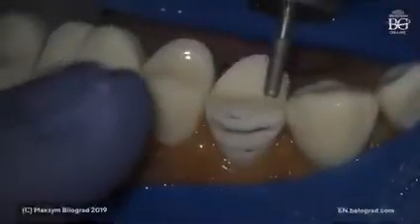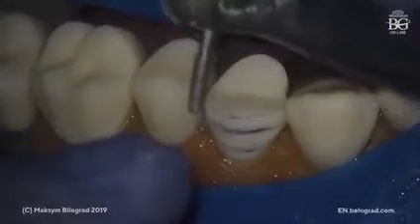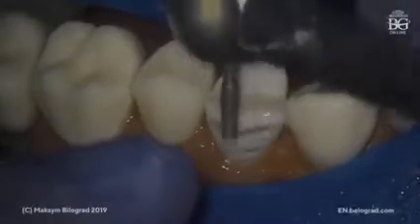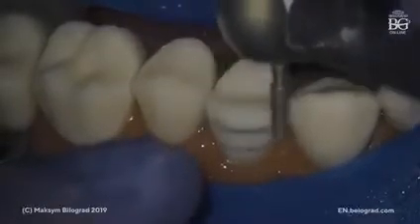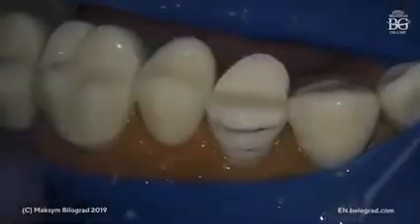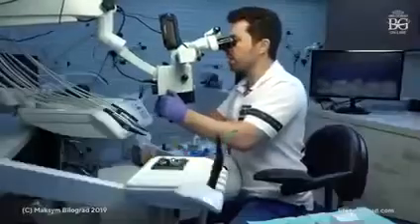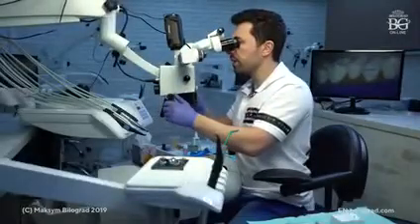Okay, so now we have prepped the occlusal surface and we're ready for the buccal surface, and we can finally turn the head of our patient back to a more ergonomic and comfortable position. But just let me take this corner out. Yeah, now we can change the position of the patient's head to make it more straight, chin slightly down. Okay, so we will be able to prep the buccal surface with this angle.